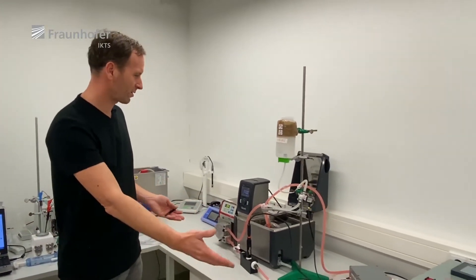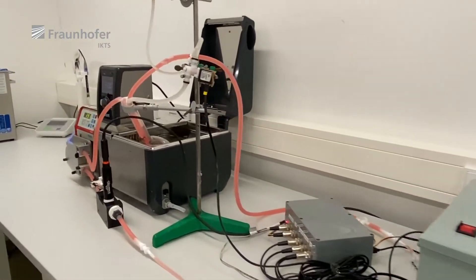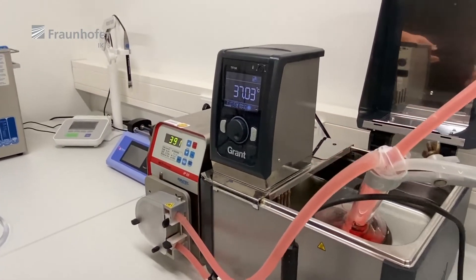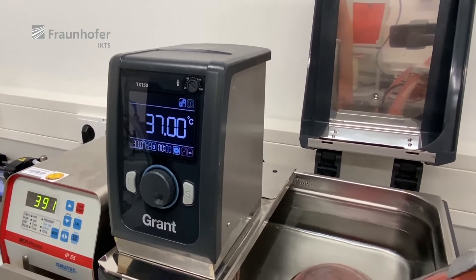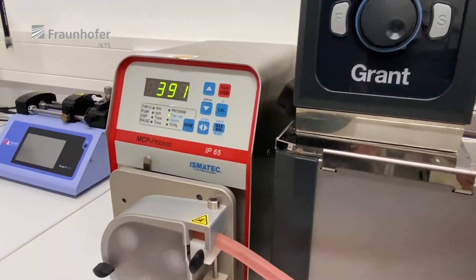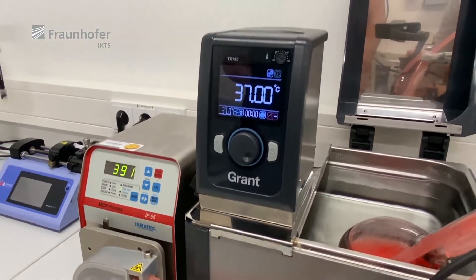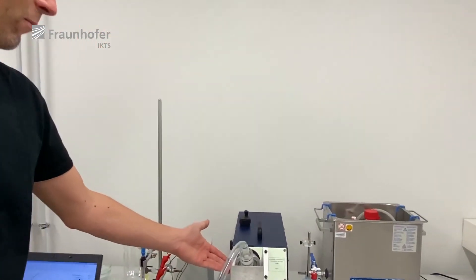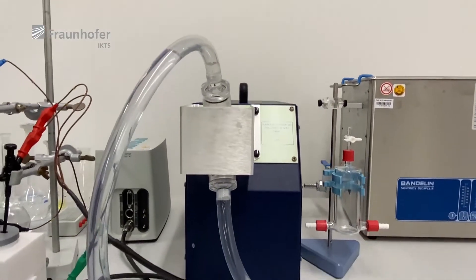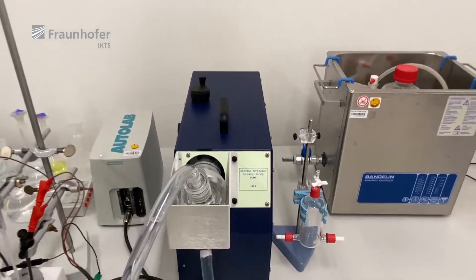To apply the stent in a controlled way to the solution, we use this setup here. First, we have a thermostat to keep the solution at a constant temperature. Then the solution is pumped using this peristaltic pump, which creates a really constant flow rate inside the system. If we want to apply mechanical stress to the stent, we also have the opportunity to use a pulsating pump to simulate a heartbeat and blood pressure. But for this setup, we use the peristaltic one.